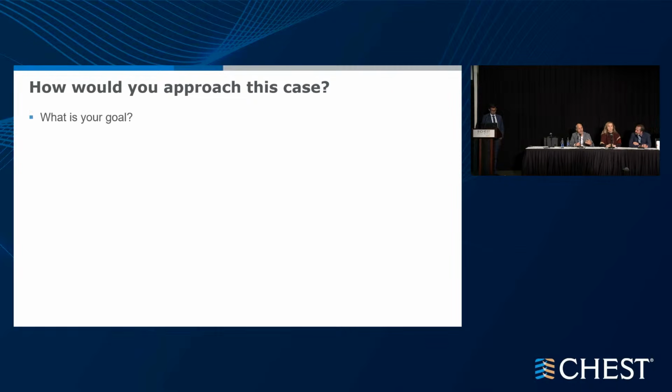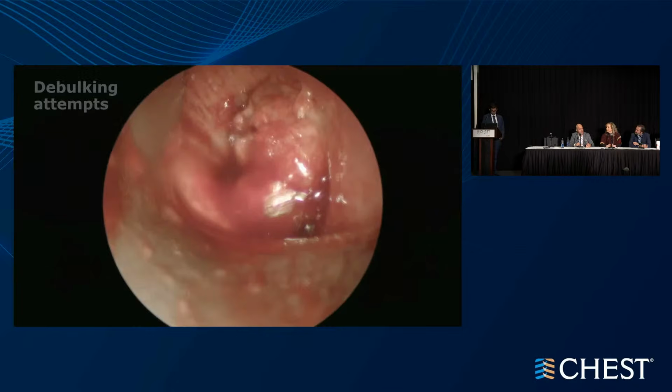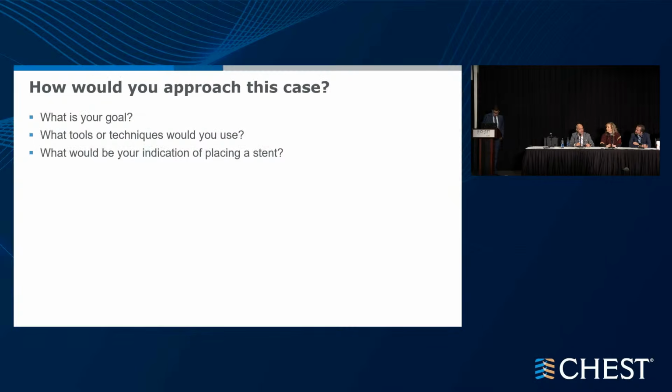From the times when laser started in laser bronchoscopy, there are actually studies that looked at successful radiation after you open up the airway versus just radiating, and again, with the 1 out of 5 chance of actually opening up the lobe. Did you have the imaging, the CT?